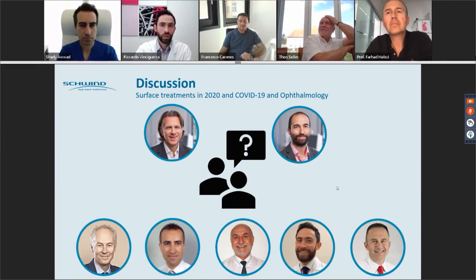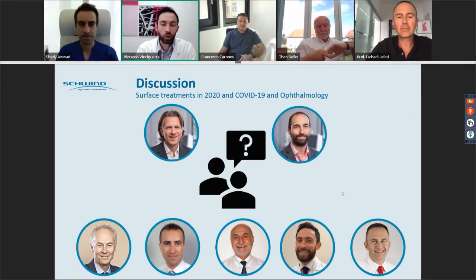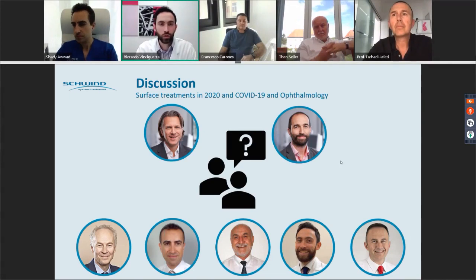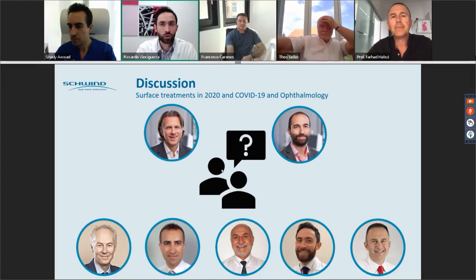This is an excellent question. Basically, our eye is not seeing through only one aberration or the other. I don't have this slide with me, but we have shown that in normal eyes, there is some software that can give you an idea of how the patient sees. If you have a good quality of vision and you deselect some aberrations, then you might have a worse vision than what you started with. So it's very important to have automatic software that makes an automatic combination of the aberrations that are most significant for the reduction in vision.